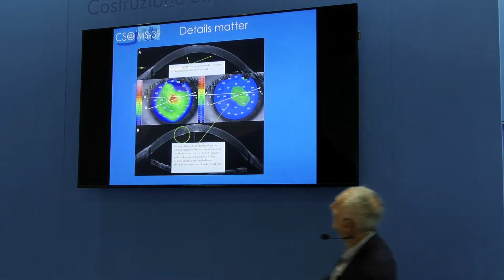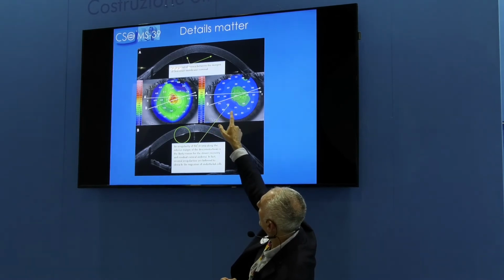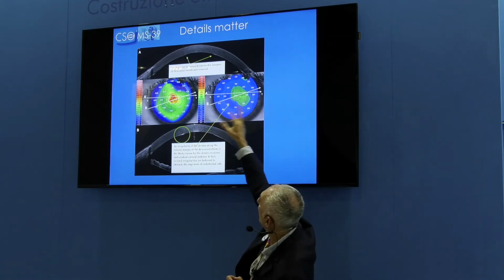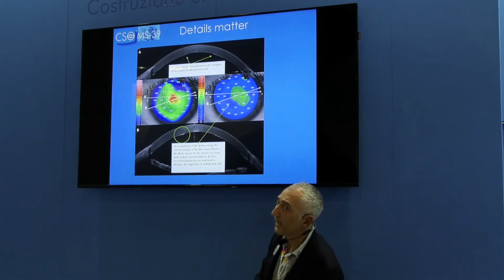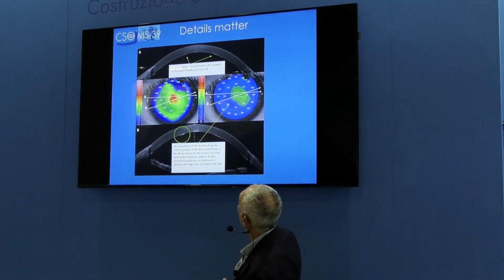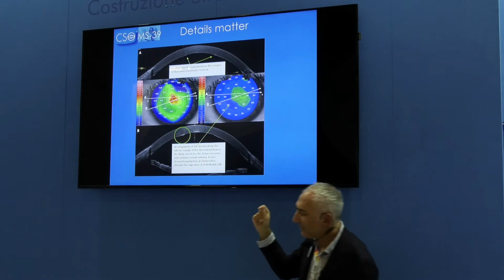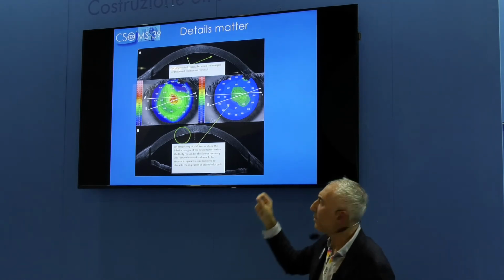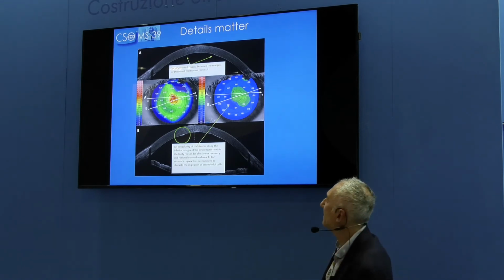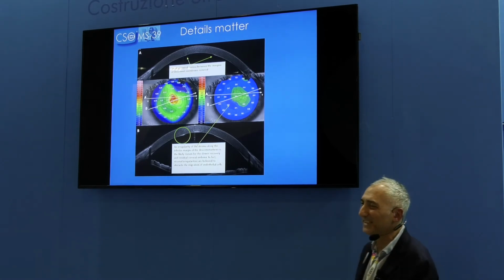And here we can see beautifully how the descemet removal can be very well delimited in the image. We can see where it's left and where we took it away. This is after the surgery, so there is no edema anymore, and the endothelial microscopy shows us that in that area it's around 1,000 cells per square millimeter. Yeah, it's low, but it's better than nothing.